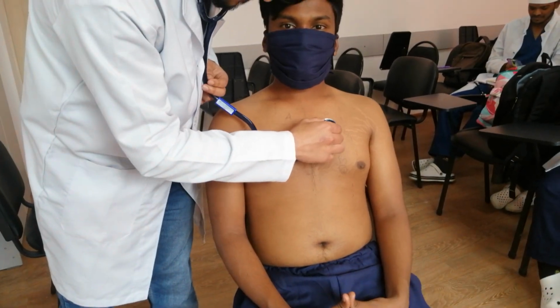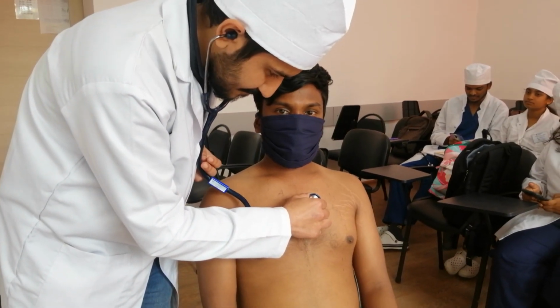Third point is pulmonary valve point, which is located on the left side, second intercostal space towards parasternal line again from mid-clavicular line. Okay. Smooth.